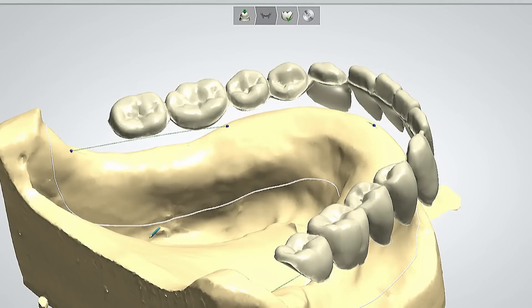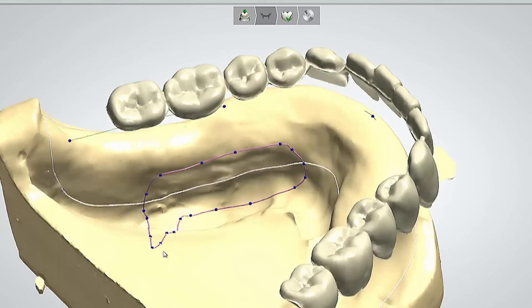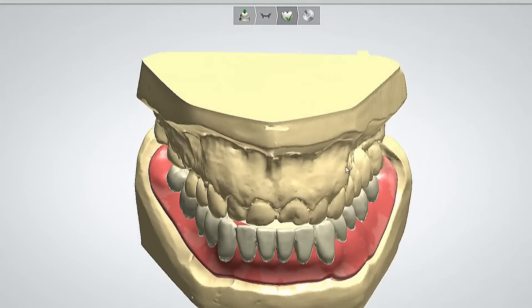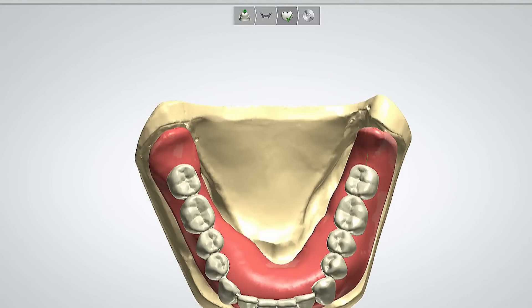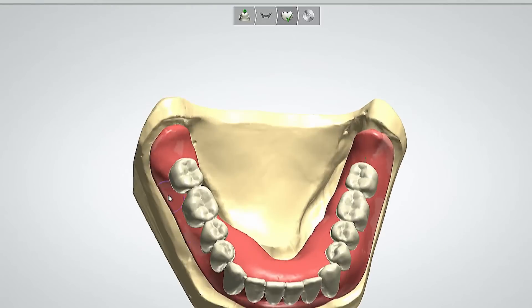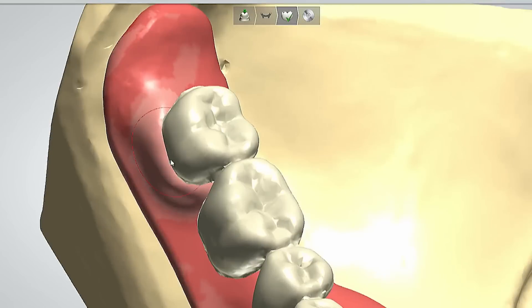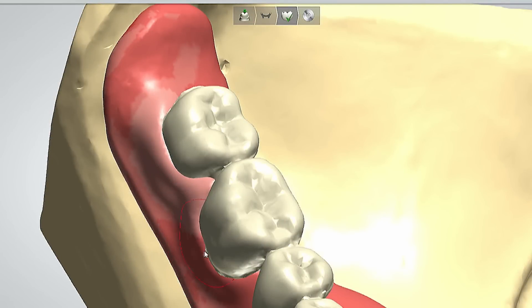You can see the technician going through and selecting some of the borders and making slight modifications. This type of software gives the clinician and the technician a lot of benefits. One of the biggest benefits for me has been that the time-consuming aspect of setting denture teeth has been really eliminated by CAD/CAM technology, so the technician can quickly go through and set the teeth.